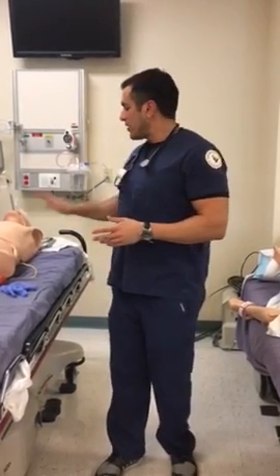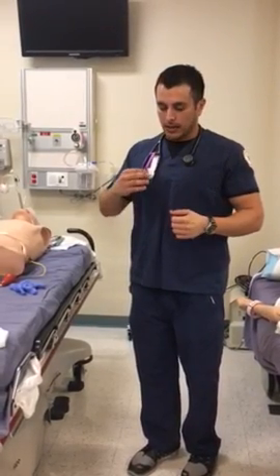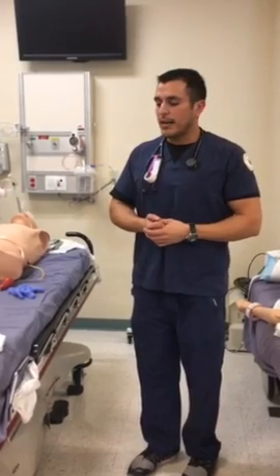On the chest x-ray, once we get it, what we would want to see is the tip of the tube about 2 to 3 centimeters away from the carina.